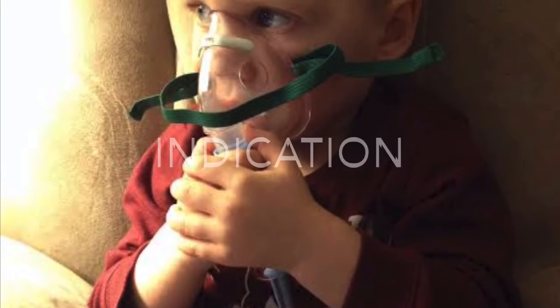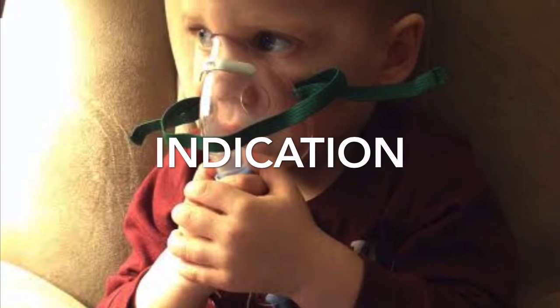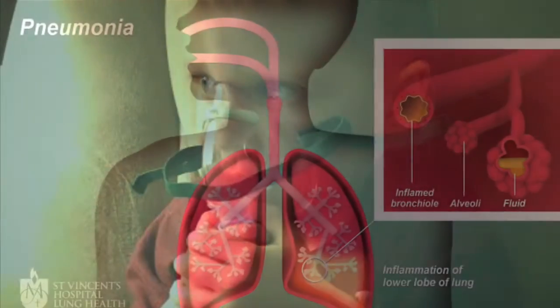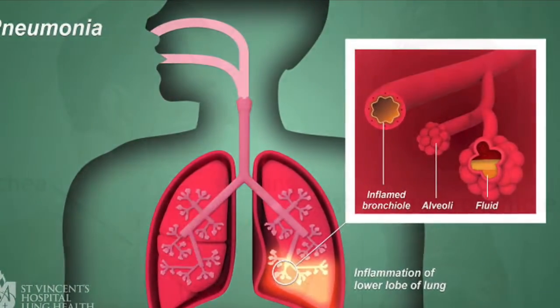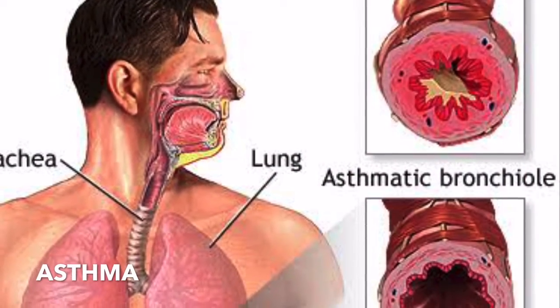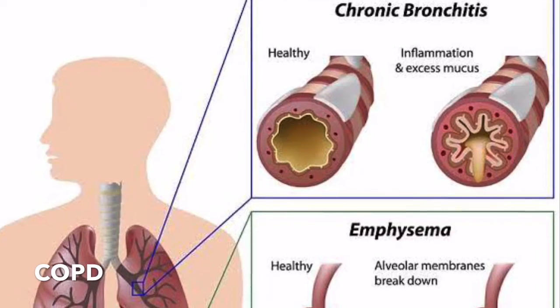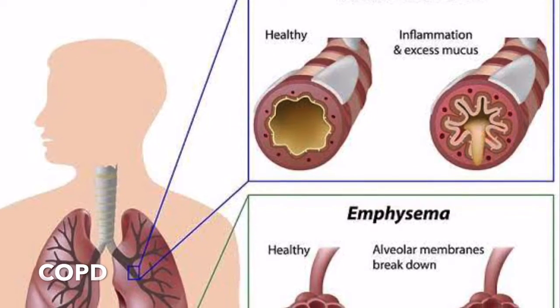And for the indication, if you have a medical disease that affects your breathing, such as pneumonia, asthma, chronic obstructive pulmonary disorder or COPD, or respiratory infection, a nebulizer can be used.